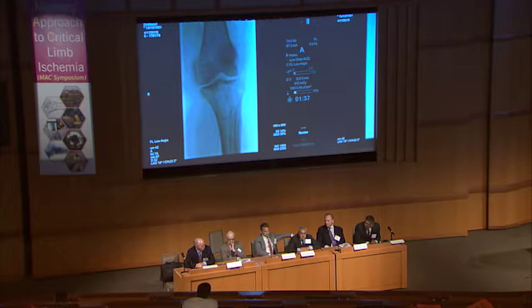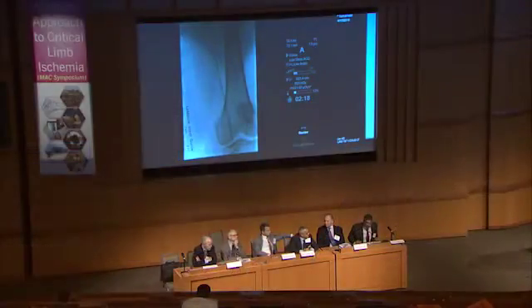This is an unusual case, but normally if you're going to put Viabahns in, we would treat the entire vessel with a Viabahn, post-dilate it very aggressively, make sure it's well expanded, and also try to avoid geographic miss. You don't want to be dilating outside the stent graft if you can help it, to reduce the risk of an edge restenosis. And nowadays, as Tomas mentioned, we can use drug-coated balloons at the edges too to reduce the risk of edge restenosis. So a lot of technical issues when you're using Viabahns. And the last thing, which we've already talked about, is you want to make sure you have good outflow. So at the end, we need to make sure we get this dilated below the knee so there's good flow through there.